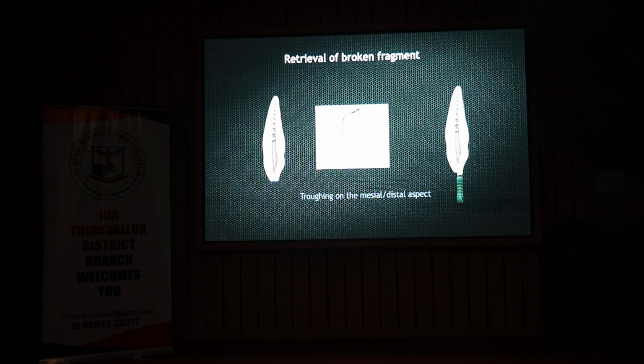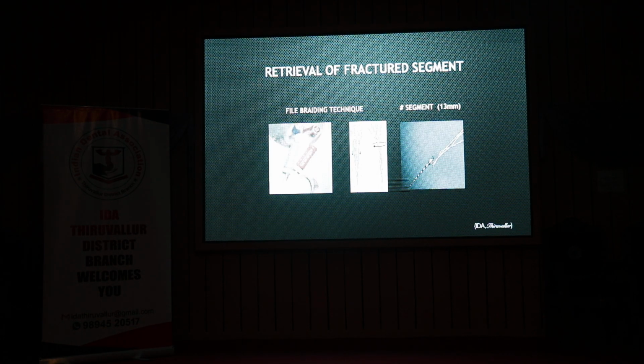If you are using it, you can be very, very precise, and you can free the broken instrument from the root dentine. In this case, we use 3 small H files. Okay, and then we did a braiding, and then we pulled it out.